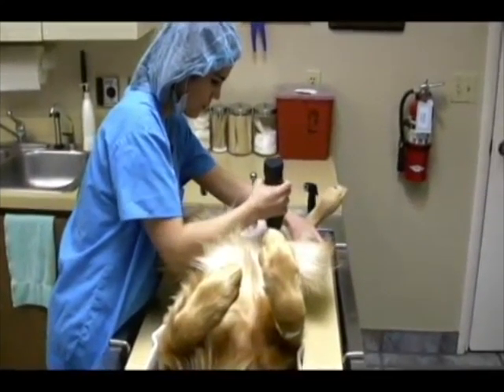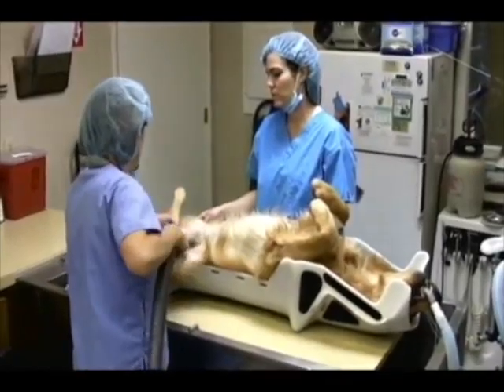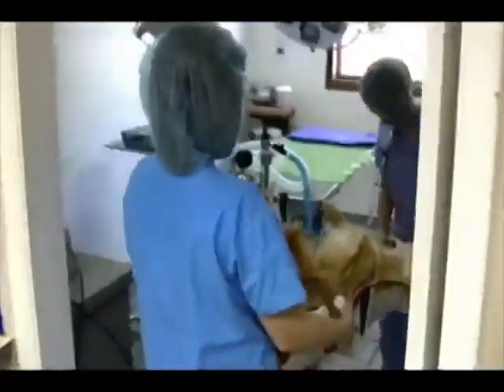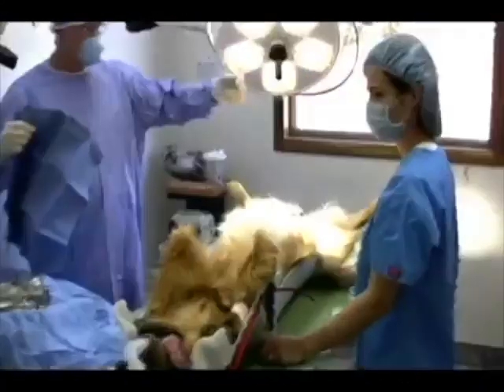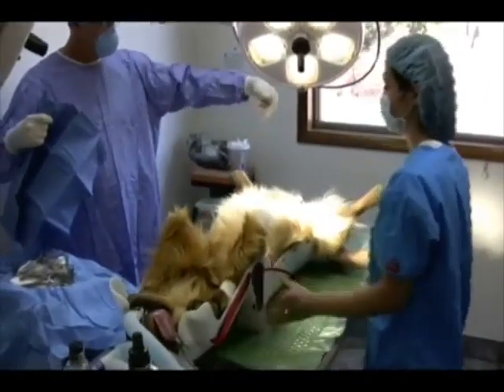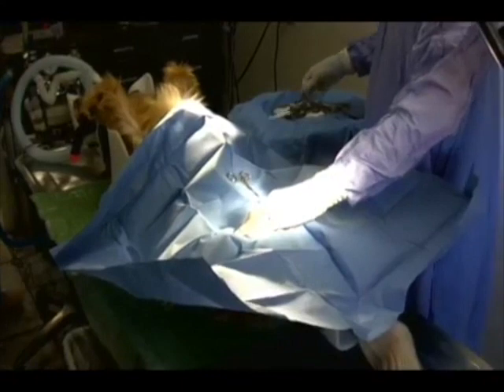Beginning with surgery, the Positioner offers several advantages over conventional positioning. Patients can be prepped, then safely transported to the operating room, and you are ready for surgery. The time-consuming need for tie-downs is eliminated. Once on the surgery table, the patient can be easily moved about to suit the needs of the surgeon. Even large, deep-chested breeds stay in perfect dorsal recumbency for the entire procedure.